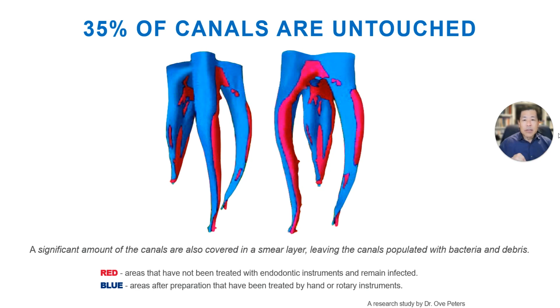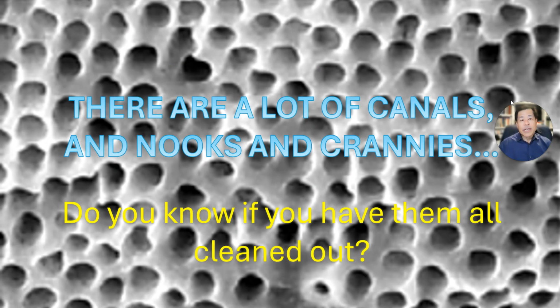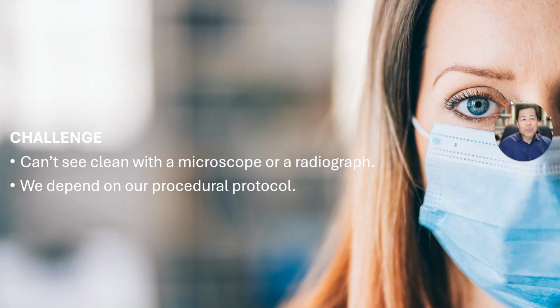And yet when we are done, we are dependent on our procedural protocols that they have helped us clean the canal system out, but yet we don't know. We don't know how much bacteria is still in that canal system. Well, that's where, with all these little nooks and crannies, all the tubules, that even when we do the best job we can with our instrumentation and our irrigation, a tooth will still fail to heal. And that's what makes me lose sleep.